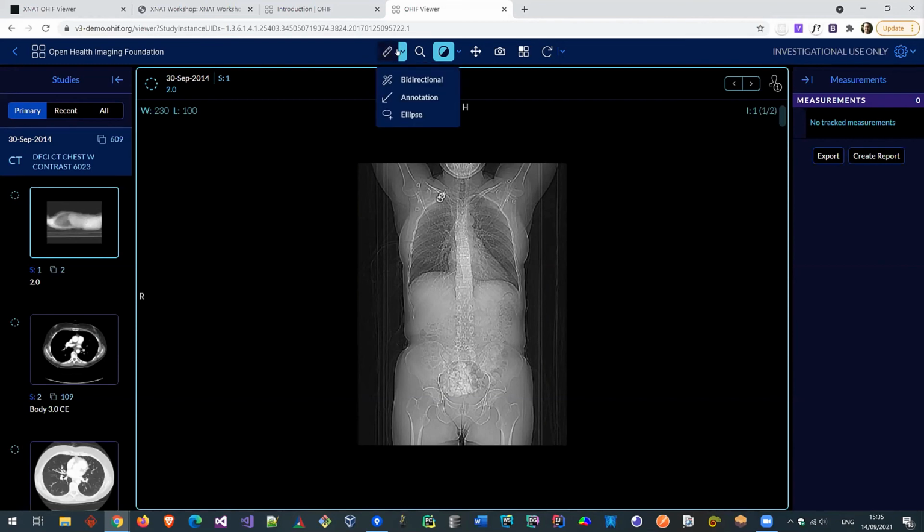So they dedicated a specific toolbar menu for annotation, and for the other tools another toolbar menu. If we're talking about our ROI toolbar menus, they will come somewhere here. The generic structure is about the same. Technically and coding wise, it's making it easier to integrate other third-party tools. So it's supposed to be less hassle in adding new features for us. Supposed to be, but I didn't try building it yet.